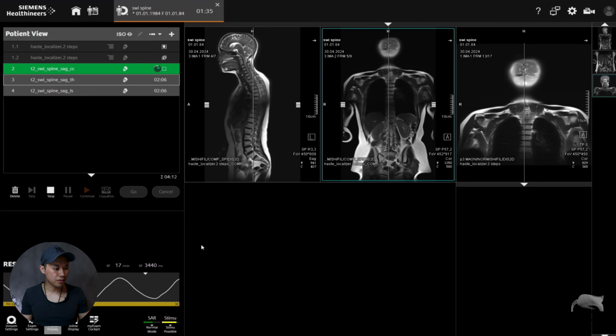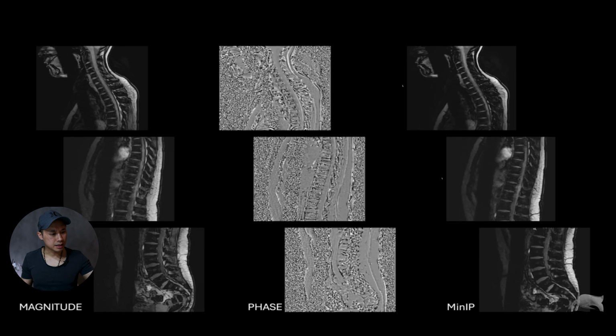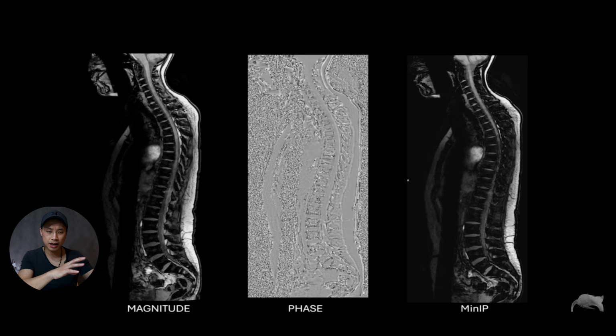All right, the result is like this. You can see there are cervical, thoracal, and lumbar, three different images: magnitude, phase, and minIP. What I usually do here is compose them all together, so we have a final image like this. This is the final composed image like I showed you on social media. Much nicer to look at and a great overview for the radiologist.